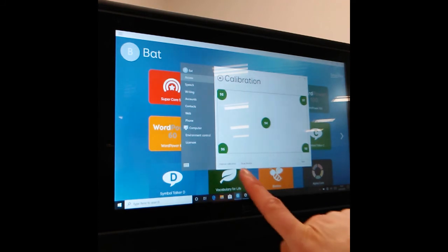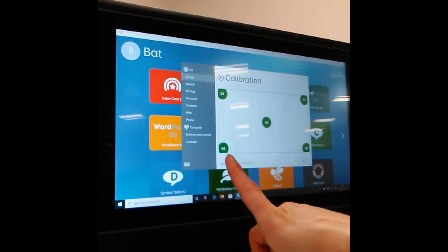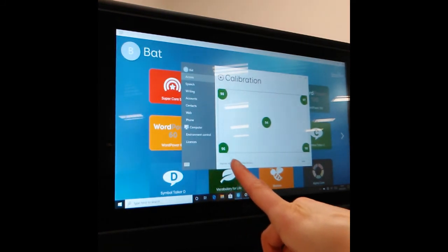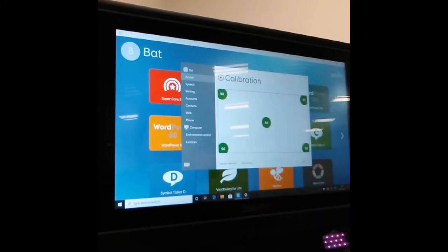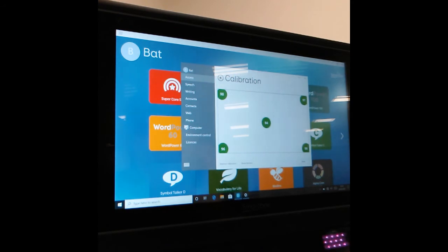You can also do this Improve Calibration option, which will enable you to work on the calibration and see if it can pick you up a little bit better.